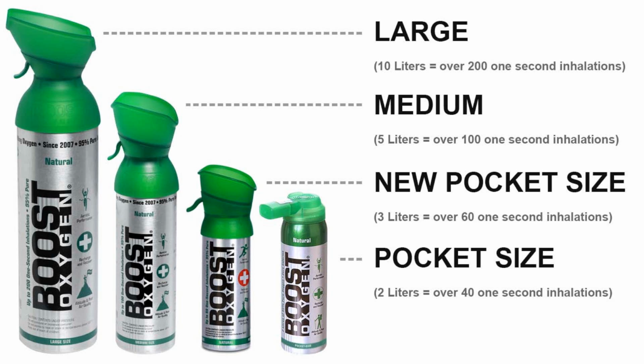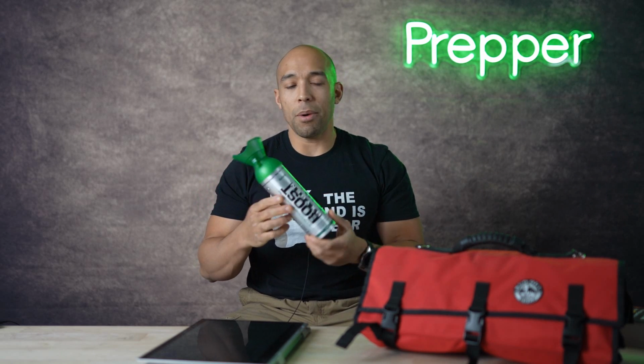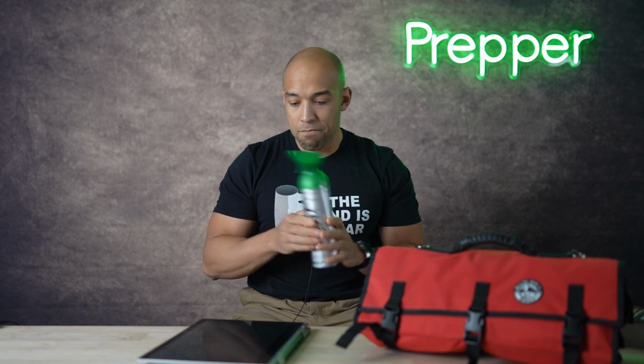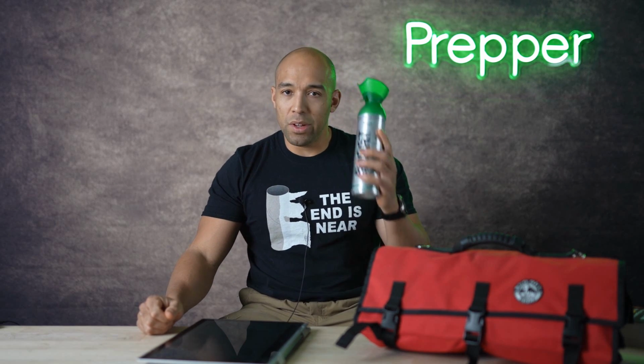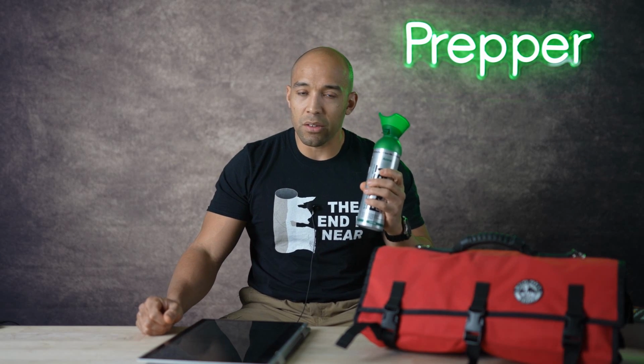This big can provides you with 10 liters of oxygen. It is virtually weightless. You cannot tell if the can is empty or full. This gives you about 200 puffs of oxygen, okay? But only 10 liters. So at best, this is going to give you 10 minutes of potential life support.